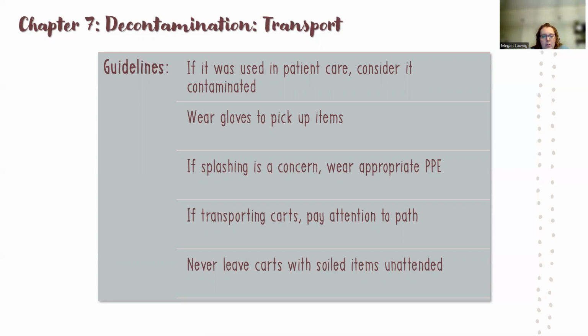And if you're using a cart to transport your supplies back to decontam, always pay attention to your path because not all facilities have their sterile processing department centralized. It may be farther away from certain areas that need things brought to sterile processing, and you have to push these case carts or whatever it is throughout the hospital to get to your department. So be careful, you're going to have patients walking the hall and other employees. Sometimes you have a lot of turns. Hospitals are notorious for being mazes. So use the little mirror in the corner to double check, take your time, and just watch where you're going. Sometimes it's hard to push those carts.